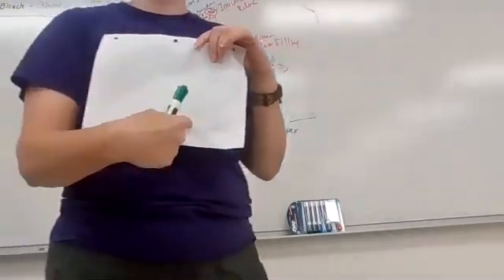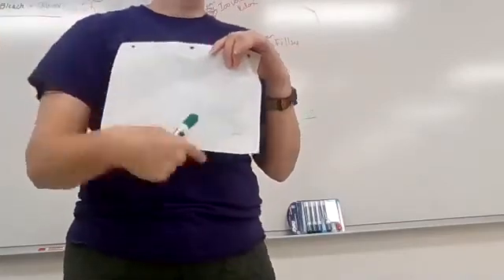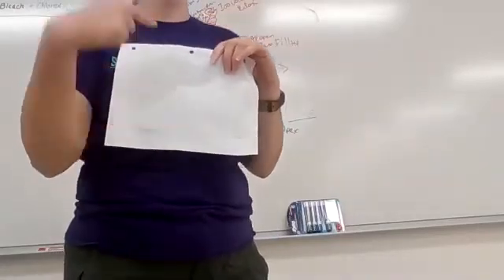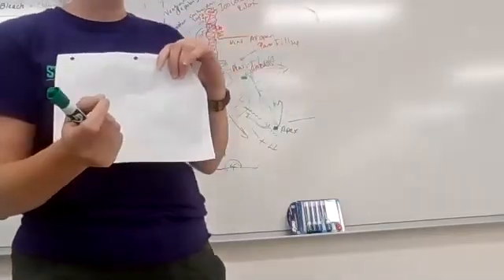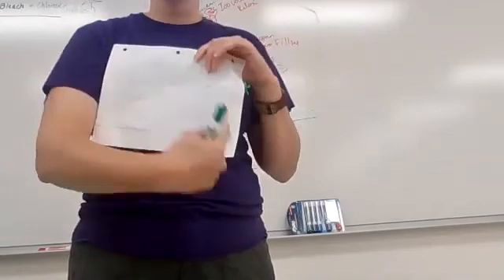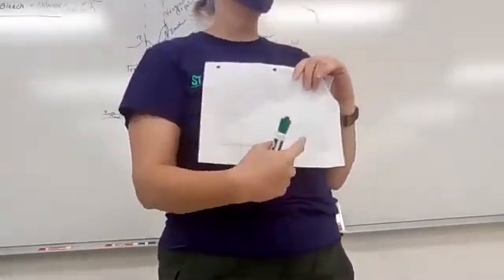If I point to the QRS complex, you know, that's the QRS complex. The QRS wave would also be acceptable. What does it represent? It represents ventricular depolarization. It's masking atrial repolarization, okay? The last wave is the T wave. What does it represent? The ventricles are repolarizing.